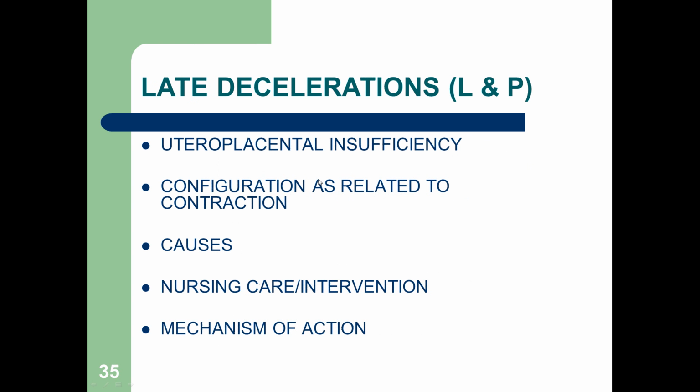Late decelerations, that's usually due to placental issues, okay? When the utero-placental reserve is adequate, fetuses normally tolerate the transient stress of repetitive contractions, but with decreased utero-placental blood flow, fetal hypoxia can take place, which leads to late decels, okay? Late decelerations usually occur in the normal fetal heart rate range, but may be subtle or they could be obvious. You've got to check your variability, okay?